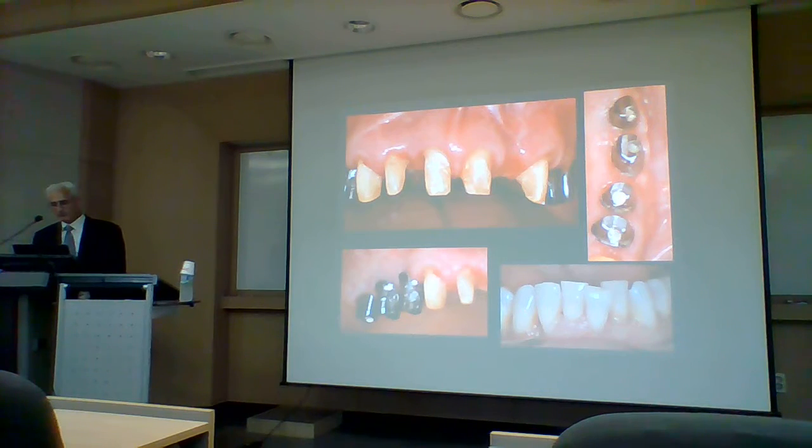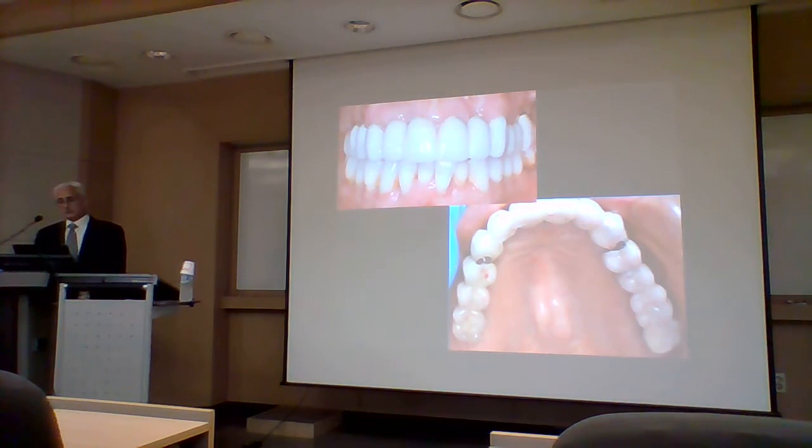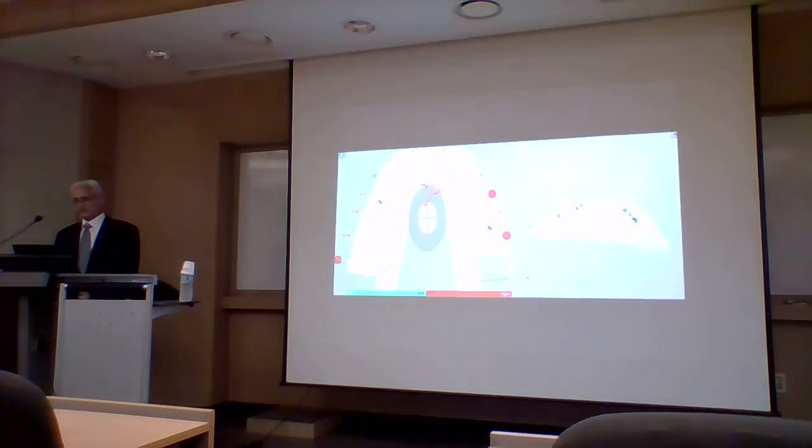And then we delivered the prosthesis. Here are the paper marks. There's no way to see the timing in the paper marks. There's no way to see the forces in the paper marks. So we really don't know whether the occlusion is good in this picture at all. So the initial T-scan data is here.